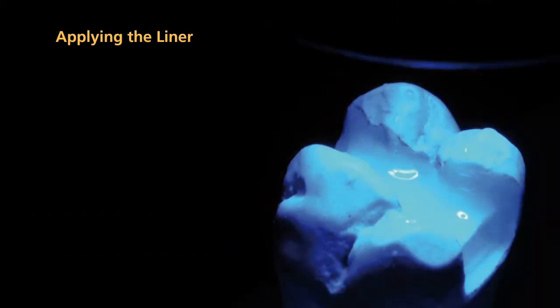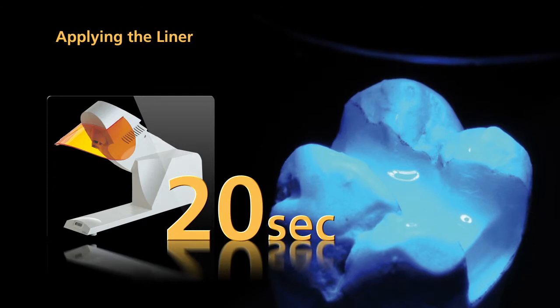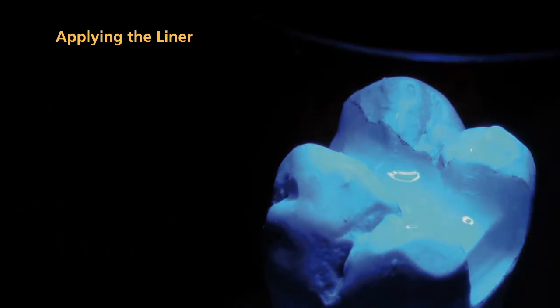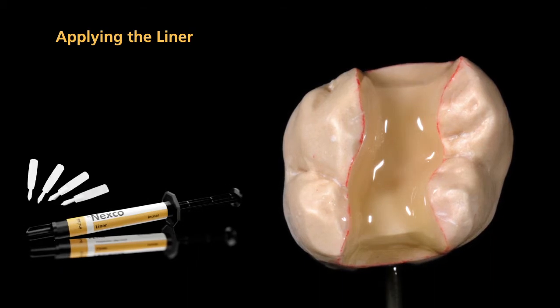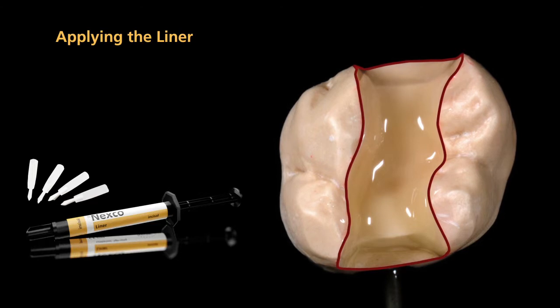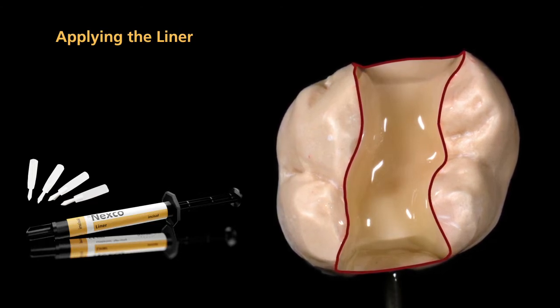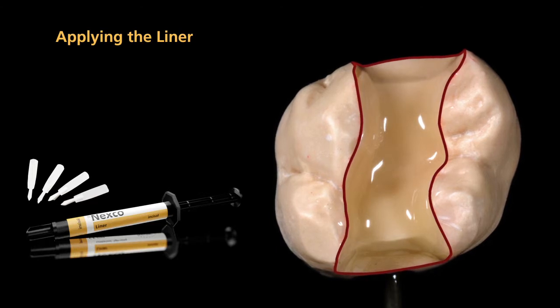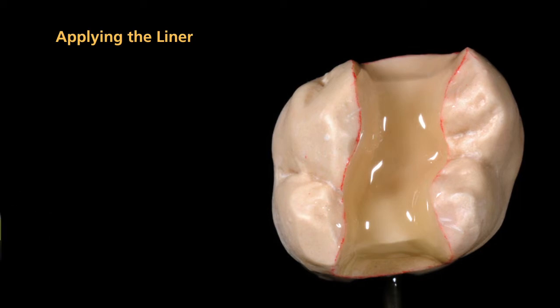Pre-cure each segment for 20 seconds using a quick pre-curing light. Now, apply the second coating of liner. At this stage, apply liner incisal to the marginal areas and along the course of the enamel. All cavity surfaces should now be coated with liner. The thickness of the liner coating should be at least 150 microns.